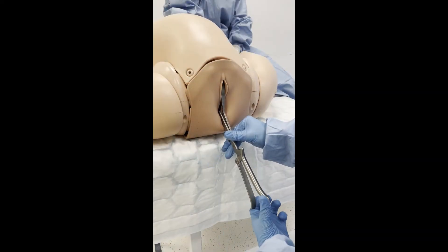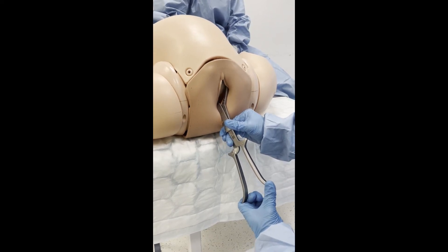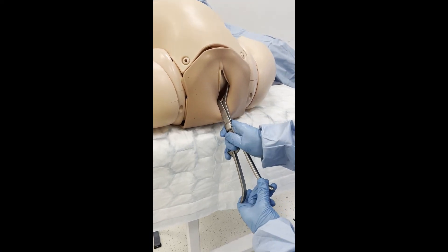Rotation is then performed, again between contractions, using no more than fingertip pressure. The procedure should be abandoned if any difficulty is encountered. Check foetal position again after rotation.